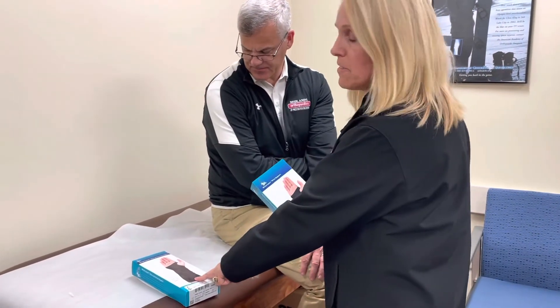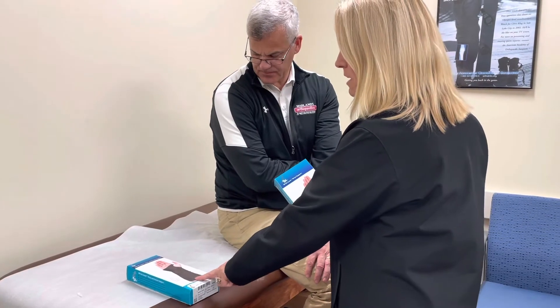The next product we're going to show is the Med Spec wrist brace. These actually come in the standard 8-inch size, but also a 10 and a half inch size if anybody should ask for a longer one.